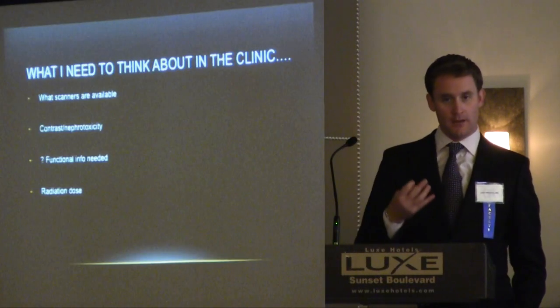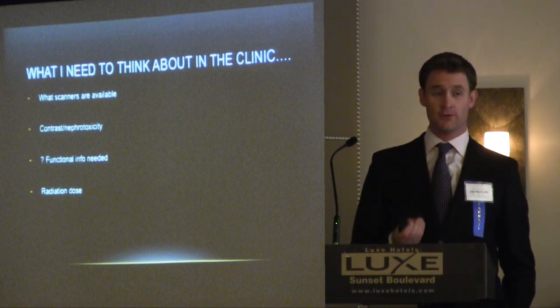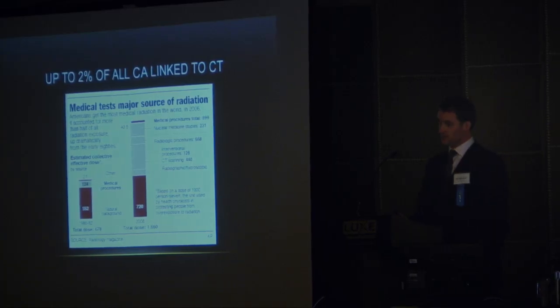And then the thing that people talk about a lot is radiation dose. This is something that physicians, nurses, people who are thinking about a CT are cognizant of, but increasingly patients are worried about this. They're worried about it because it's coming more and more into the public media about how radiation is going to give you cancer, and if you get a CT, you're going to die of that. So this is a controversial slide, because some people believe that up to 2% of all cancers in the United States at the moment are caused by CT. Some people do not believe that. I personally don't, but that is what is out there at the moment.